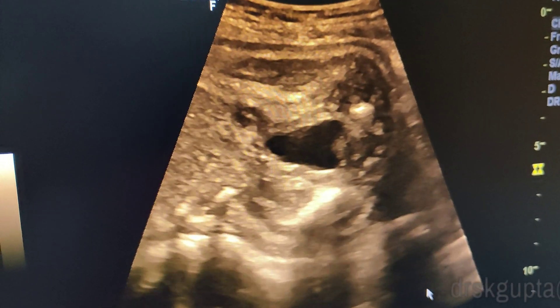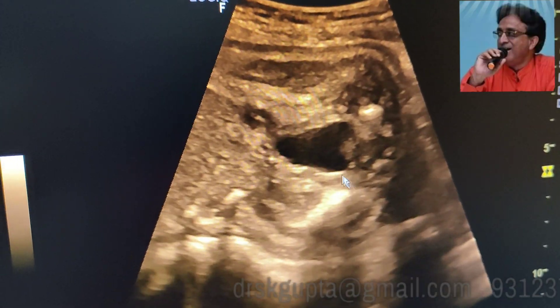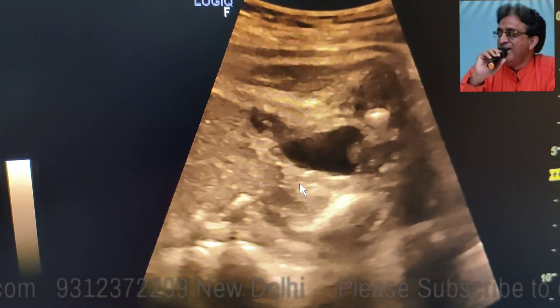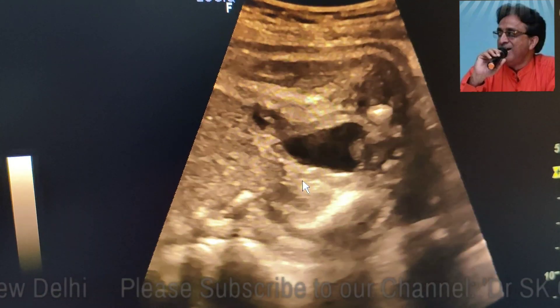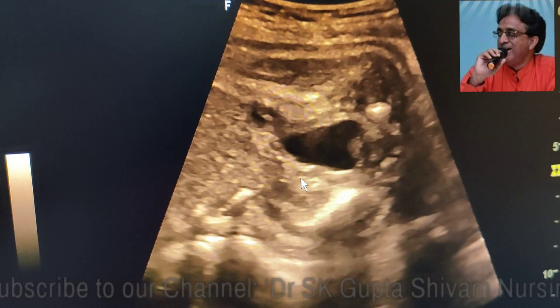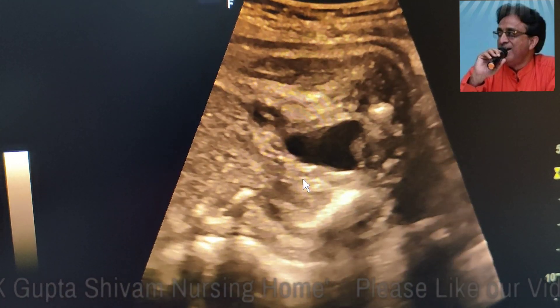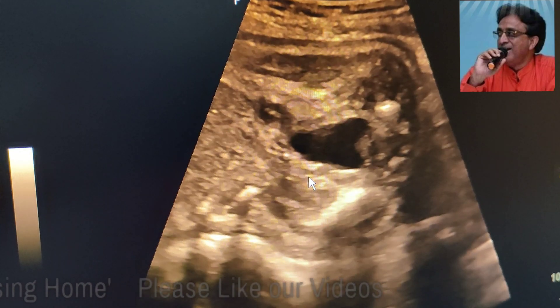This is the urinary bladder of the patient and it is pretty well filled, which means the kidneys are functioning normally. So it is not a structural cause in the kidneys giving rise to the IUGR — it is probably the nutritional cause or the vascular cause which is leading to the IUGR in this patient.